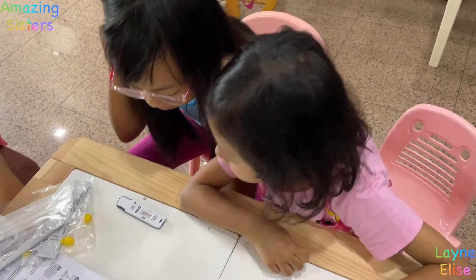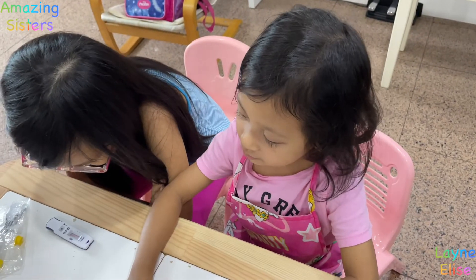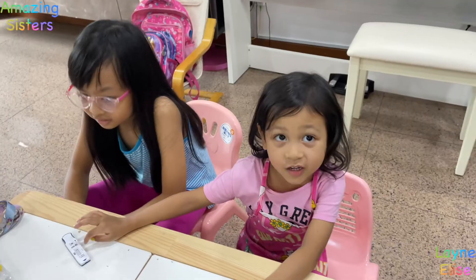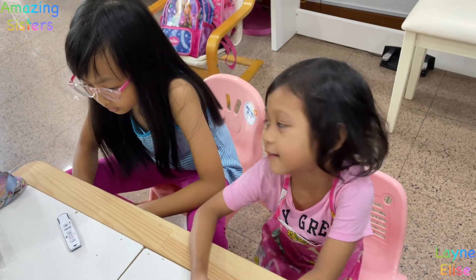I don't understand why. Elise, Elise — you're next. No. It's not that. A few moments later — oh. Look at the line over there. I think it's all pink. I think that means it's ready. It's ready.